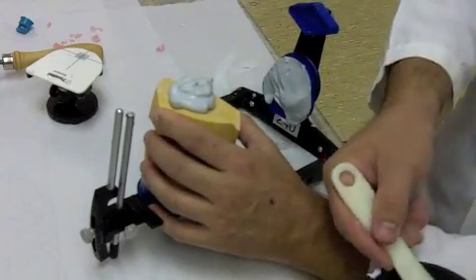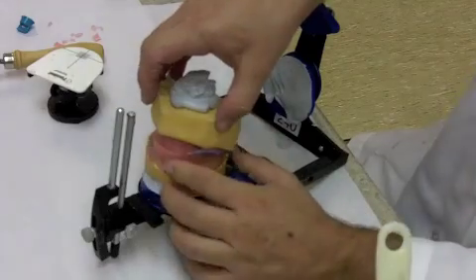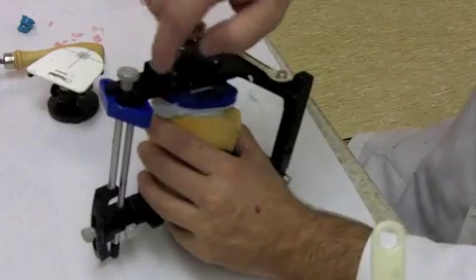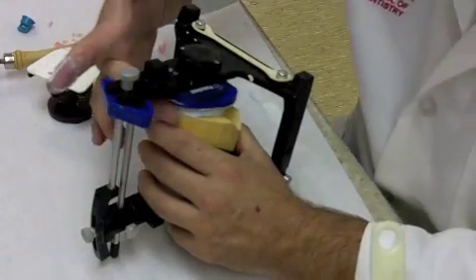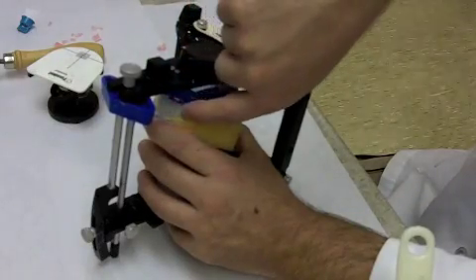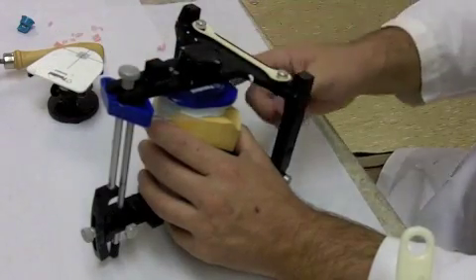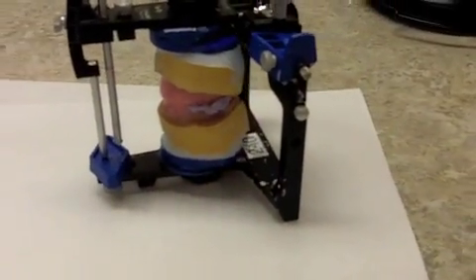So here we're adding some stone. You can use the elastics to hold the cast in place. Sometimes we've had problems with the elastics actually taking up too much space so that you don't actually have enough room for stone, and we've had some of our mountings come off because of that. So that's why you see in this particular demonstration I am actually holding the cast in place to ensure that the maxillary and mandibular cast stay in intimate contact with each other. I'm just cleaning out a little excess material, but you want to make sure that the table stays at 0.